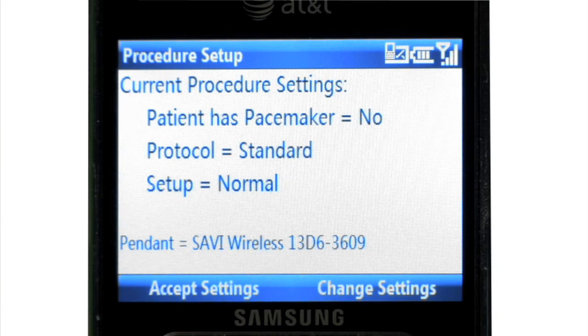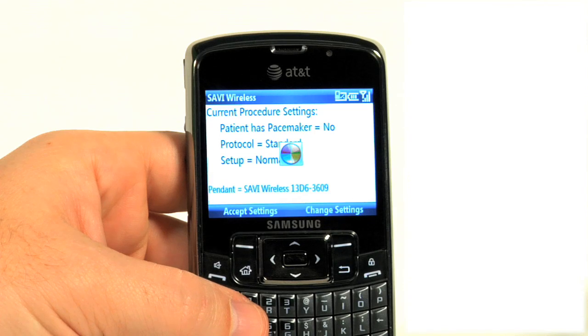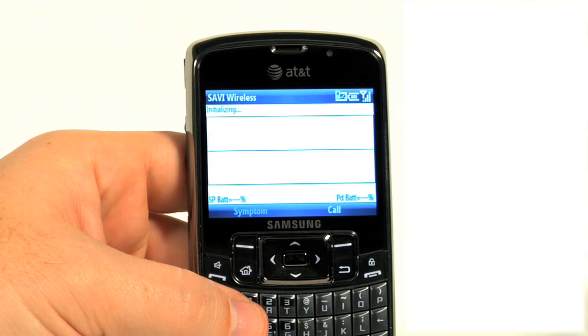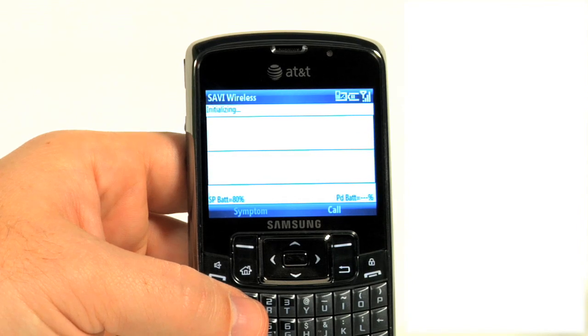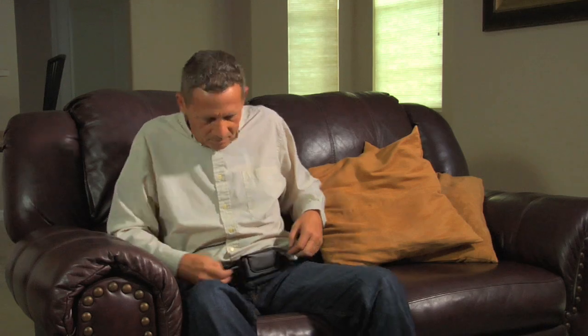The smartphone and pendant communicate via Bluetooth technology. A busy indicator appears on the smartphone screen while they connect. You'll see a screen labeled 'Current Procedure Settings.' The standard settings for an adult are preset into the smartphone. If you have a pacemaker, please reference the patient guide for instructions. If you do not have a pacemaker, press the left soft key under 'Accept Settings.' A busy indicator appears while the smartphone is initialized and learns your ECG signal. Once the pendant is linked with the smartphone, the ECG waveform disappears from the screen and 'Monitoring' with the current time appears. Once the initial setup is complete, the monitor will automatically begin to monitor your ECG. Your Savvy Wireless procedure has now begun.